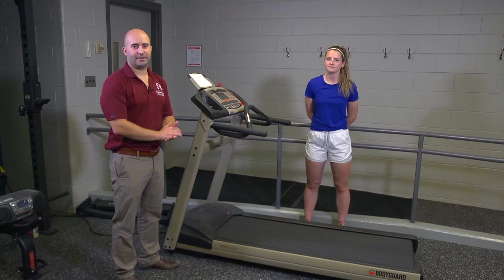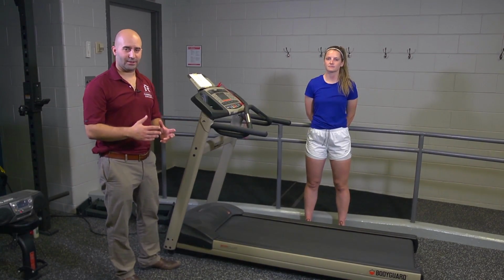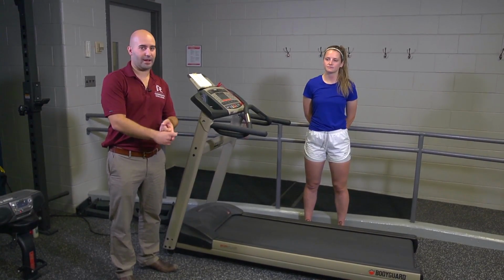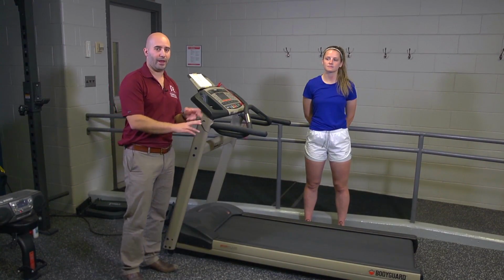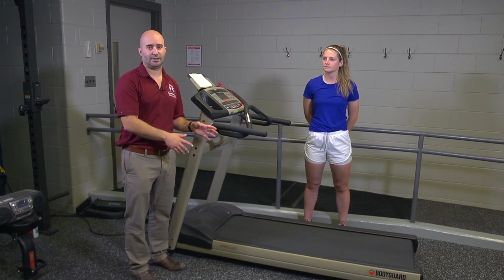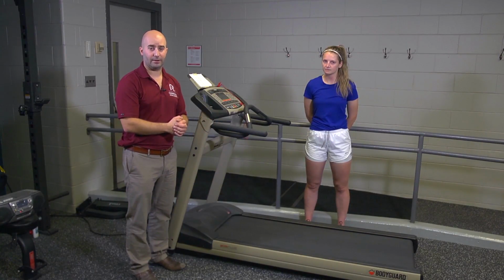So the third and final test that we'll be seeing in the FluBu lab is the treadmill walk test. Once again, this is just a different kind of test you can use to measure aerobic fitness. The same rule of 85% max heart rate as a termination criteria applies, and the same rule that if ever Clara feels uncomfortable, she feels fatigued, if she's stumbling, she can terminate the test at any point, or I can choose to terminate the test if I feel that things aren't going well.